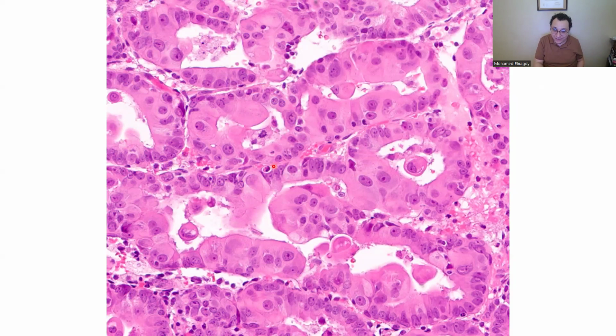But you are getting there. It looks like there are abnormal plump cells here in the glands. Like decidualization? I will mark an area and you will make it. When I mark this area, what do you see? Look at these three cells. What do you see in the borders between these cells? Yeah, that's squamous metaplasia.